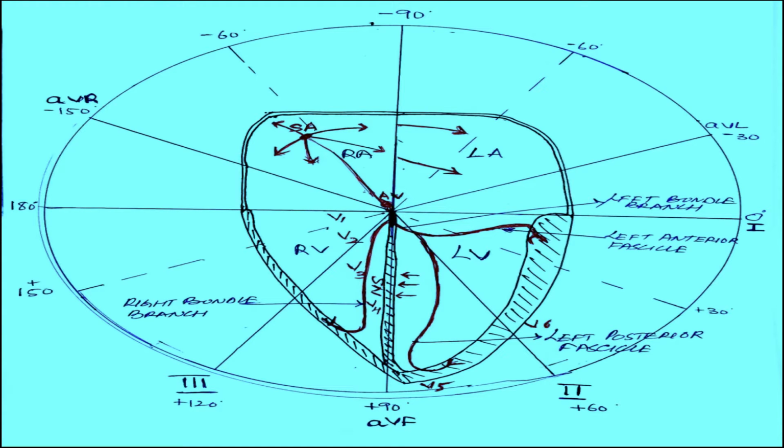At this level you should know this much. There are other conditions in which QRS can be broad, like ventricular tachycardias, AIVR (accelerated idioventricular rhythm), and torsades de pointes. We'll discuss these in later videos, but you can remember these are also causes of broad QRS.